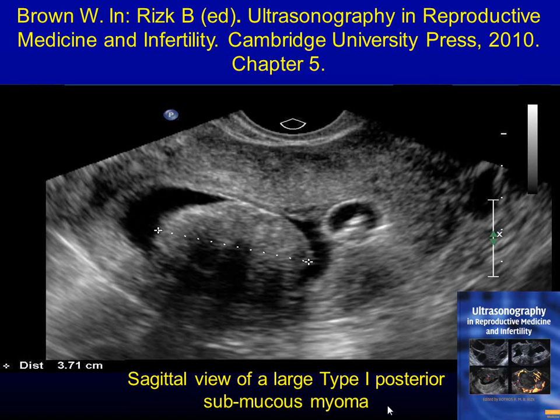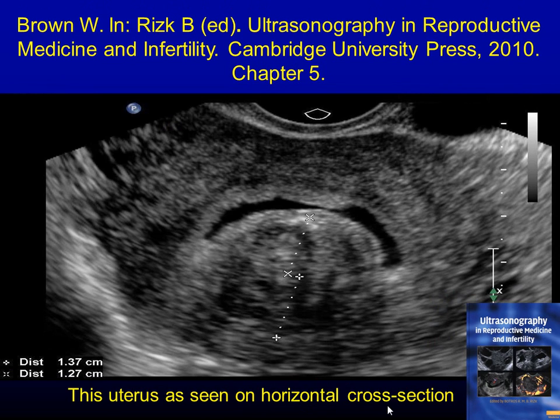So you get a postmenopausal woman, that wall is almost 1 centimeter thick. In a young woman, that could be more, maybe 2 or 2.5, but the fibroid will eat part of that wall. And part of the treatment is take the fibroid with it down. At least you need to make it flat so that there are no ridges there. And many times we remove lesions, and then I look again and find there is a ridge, so I go back and smoothen that edge. Because if you don't, it is a problem in terms of putting catheters inside the uterus for transfers and all that stuff.